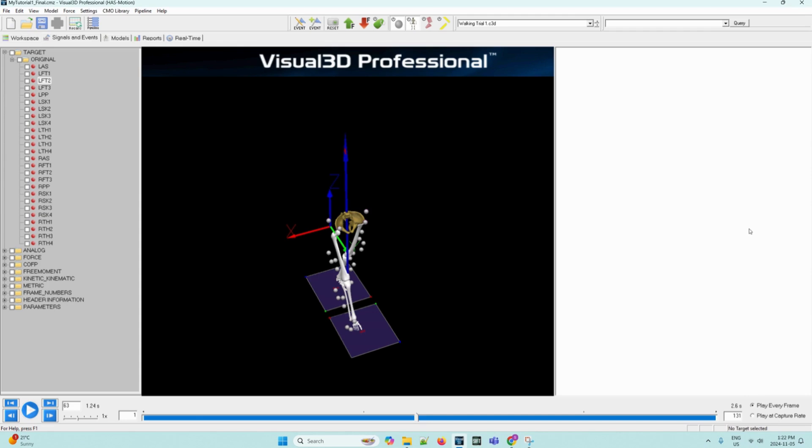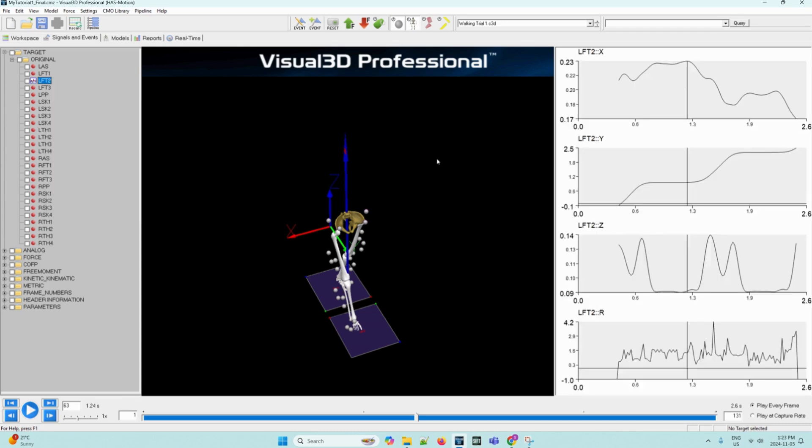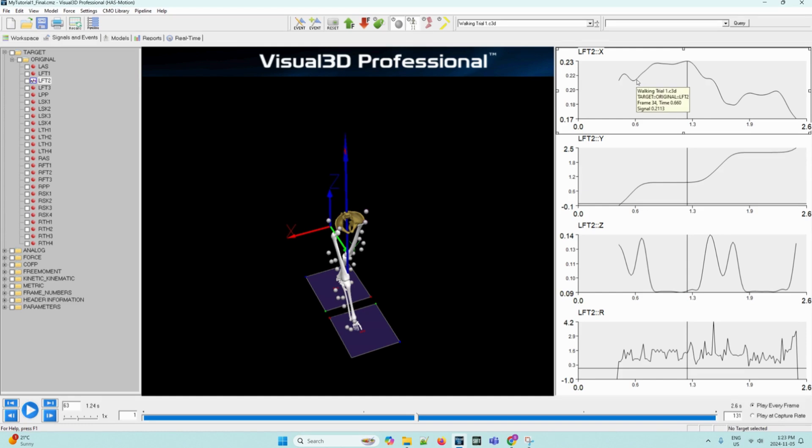So to activate an interactive signal graph, we can follow the following steps. Again, in the data tree on the left, we can right click on LFT2. Then we can select the graph XYZ and residual option and click new graph. This will populate the right side of the screen with the graphs that we need. Now we can left click to select the graph and hover the mouse over any point in order to display a yellow tooltip which will appear that displays information about that point on the graph. This corresponds to one frame of data of motion capture.